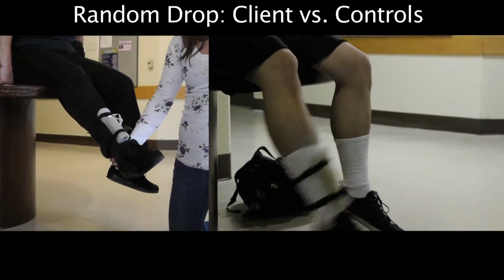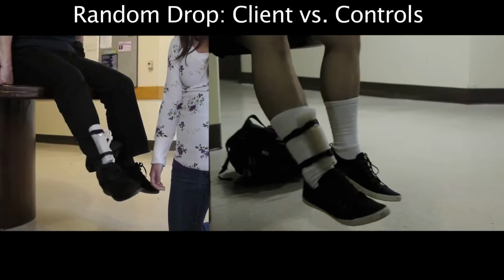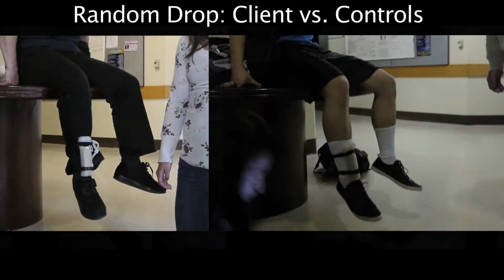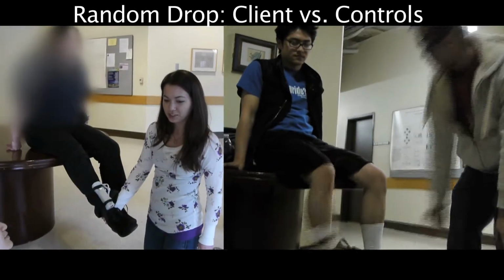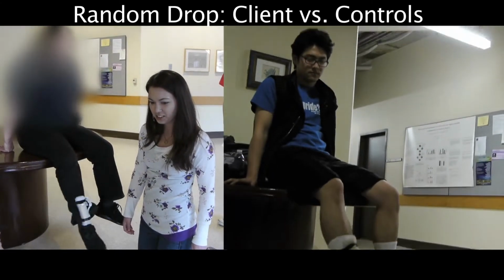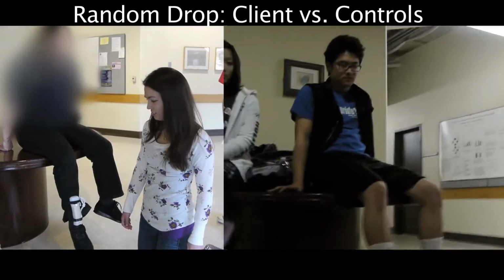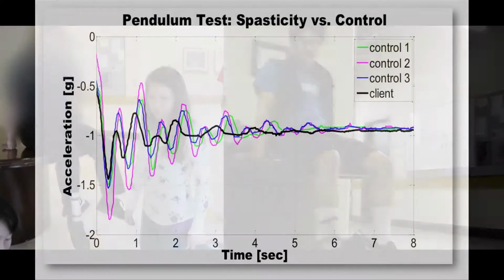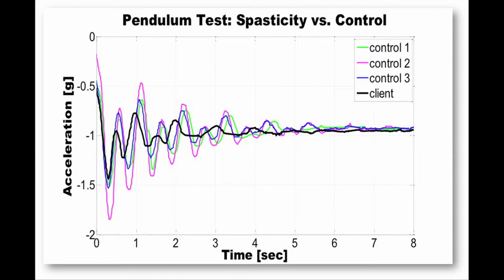In order to do this, we compared the data obtained from our pendulum tests with our client's pendulum tests. From this comparison, we were able to determine that the accelerometer is able to detect the increased muscle resistance in a person with spasticity. Also, it shows that the amplitude and decay time constant can serve as good parameters to track our client's spasticity over time.